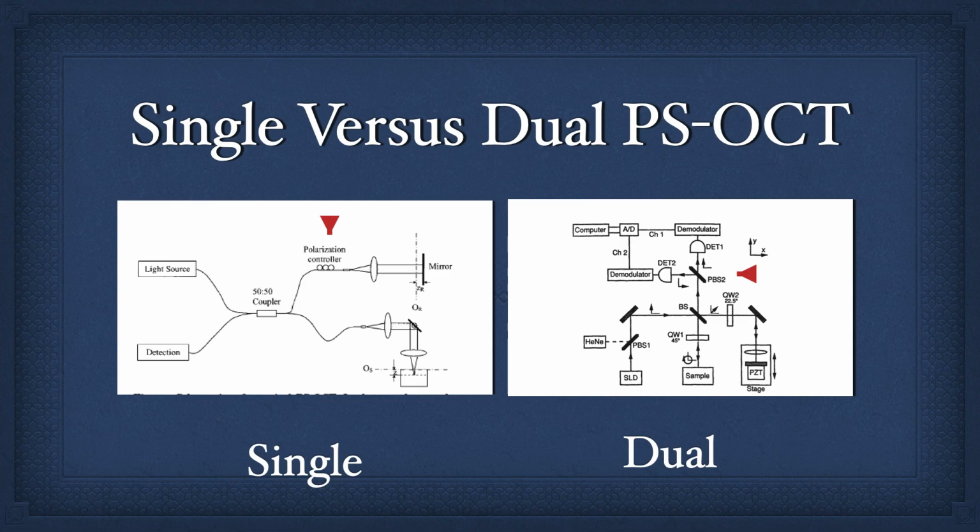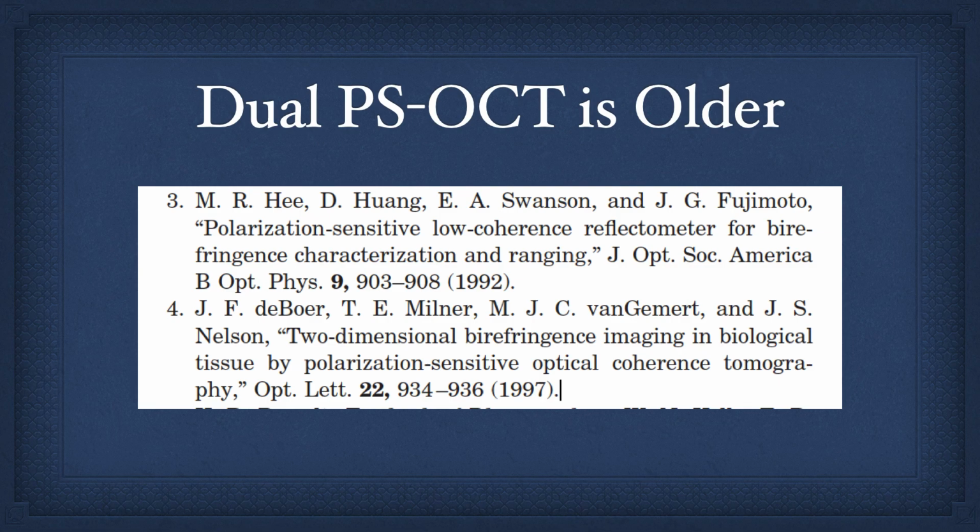In contrast, dual detector is far more complicated. If you look at the red arrow, it's pointing to a beam splitter that splits, let's say, into the X and Y component that'll allow you to tell the exact polarization state at the detector. And my problem is, at the detector does not mean within the tissue, and we're going to go into that a little bit later in the talk. And there's a lot of ways to introduce errors here, and simple is good.